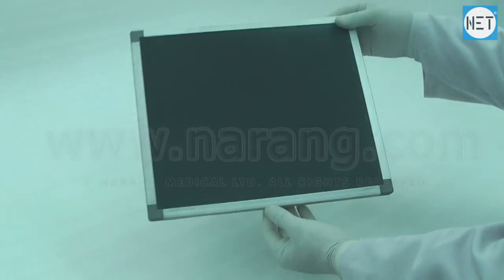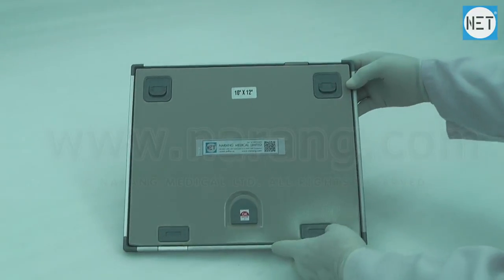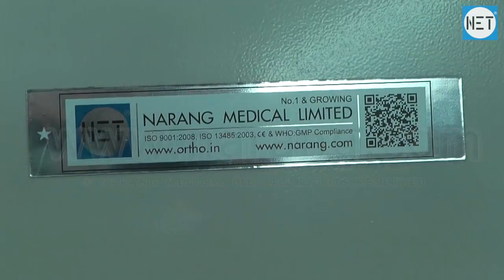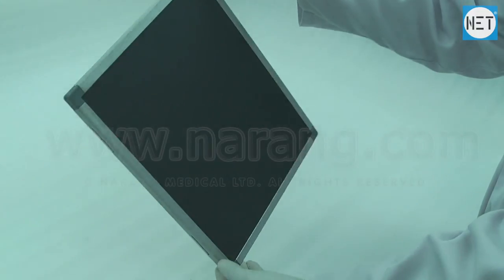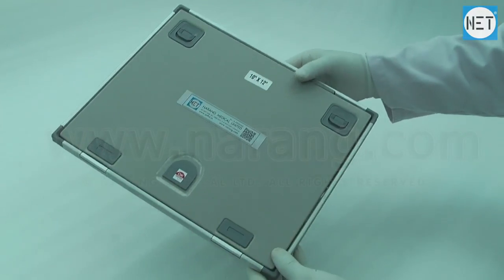Net brand X-ray film cassette. It is made of an aluminium alloy frame which is lightweight and easy to transport. It is a rectangle or square container which is used to hold X-ray films, with no sharp edges or corners.